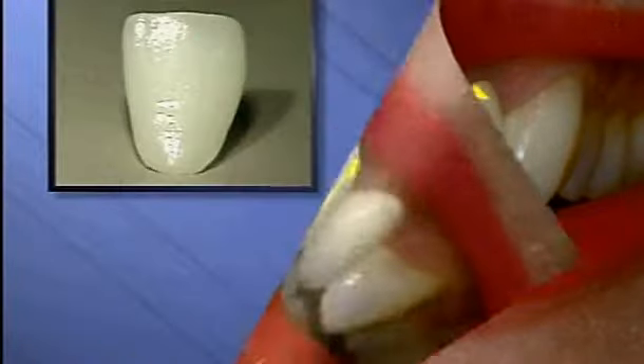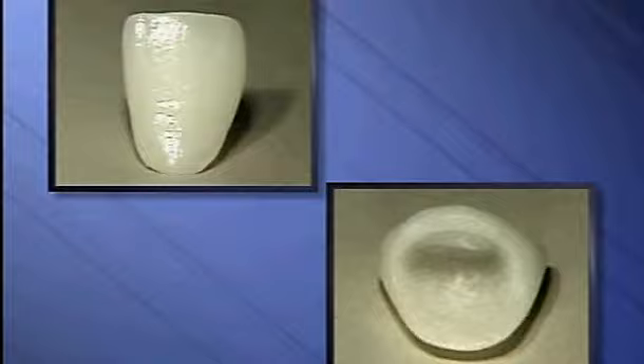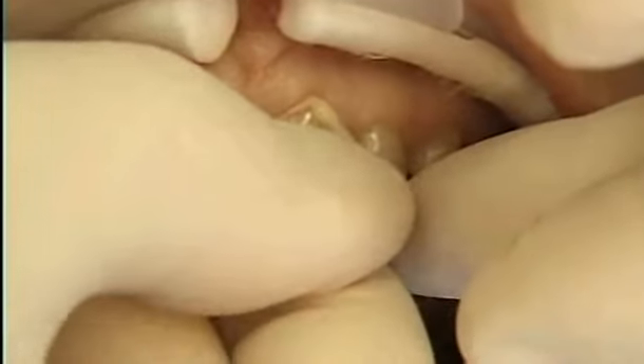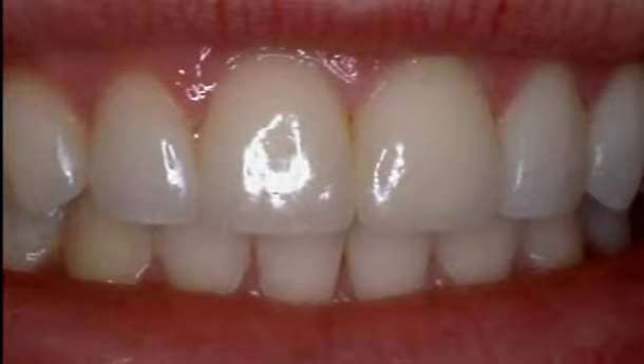New breakthroughs in adhesives and stronger porcelain materials now make it possible to make crowns entirely out of porcelain, which can then be bonded to the teeth. All-porcelain crowns maintain a translucency that makes them hard to tell from natural teeth. Without metal, the problem of a dark line at the edge of the gums is eliminated.